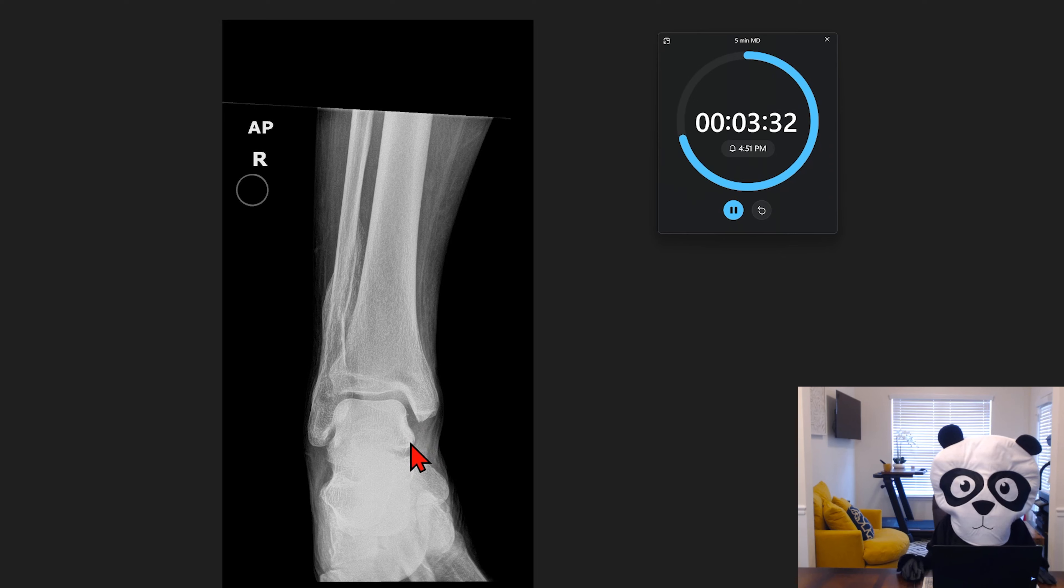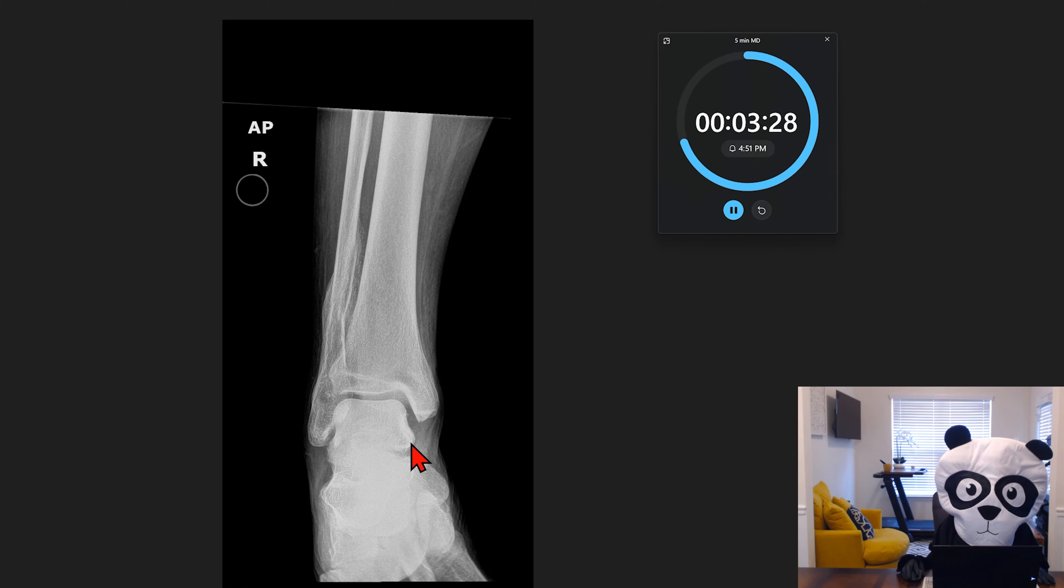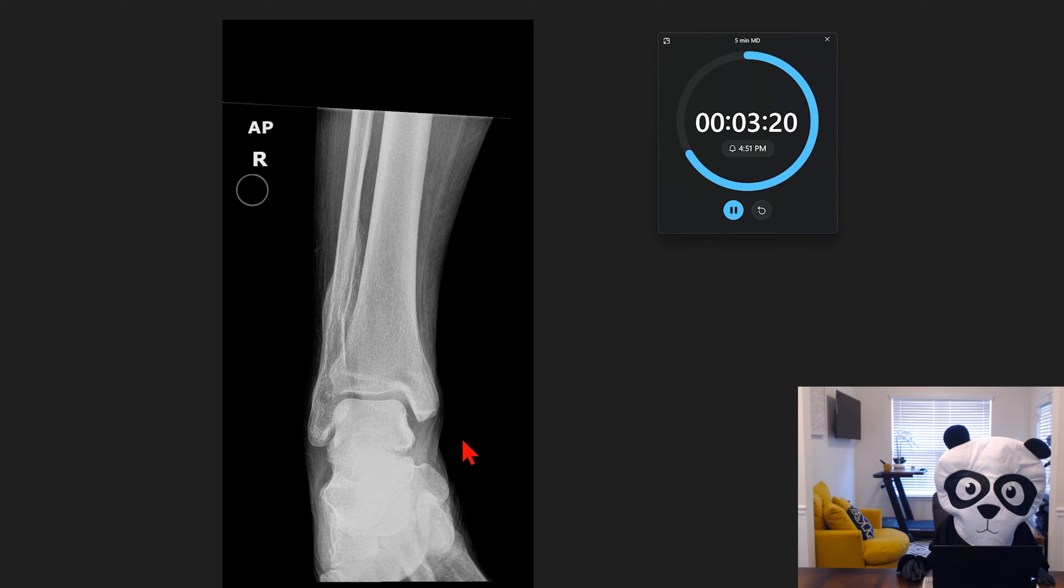So if we were to interpret findings for this exam, we could say normal alignment with approximation of the joints, smooth talar dome, no acute fracture, no focal osseous lesion, chronic post-traumatic deformity involving the distal fibular shaft, mild soft tissue swelling.